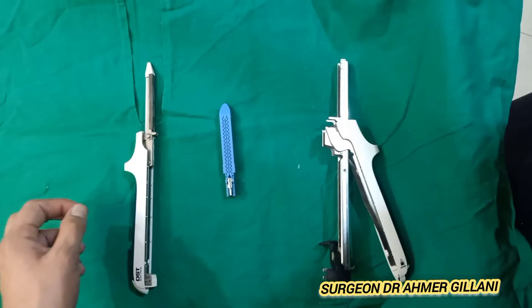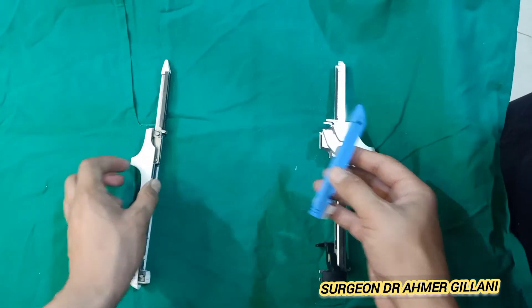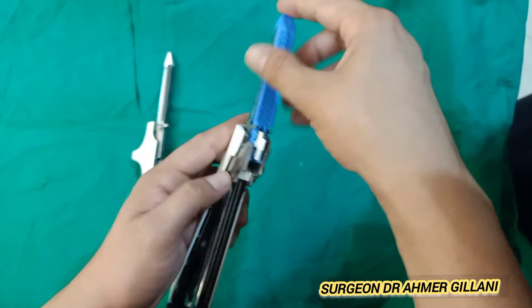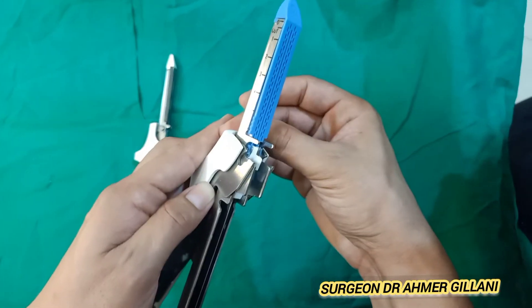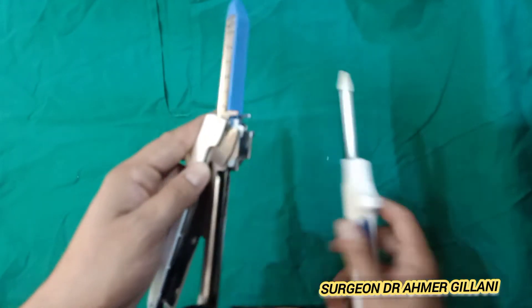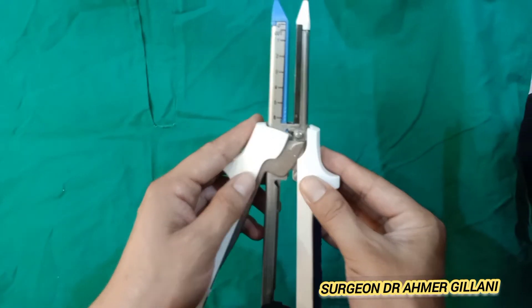Now I am going to show you how to apply the cartridge into the stapler. You will hold it like this, position it, and just press it — it will make a clicking sound and will be fixed. After that, you can make the movement like this.